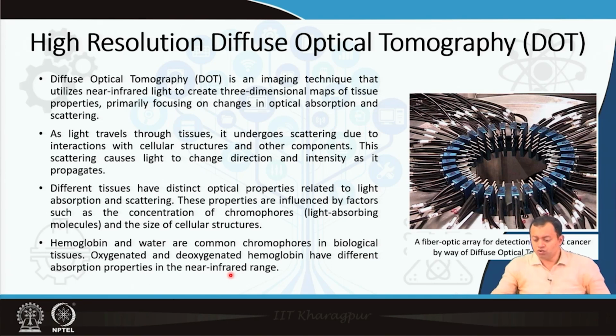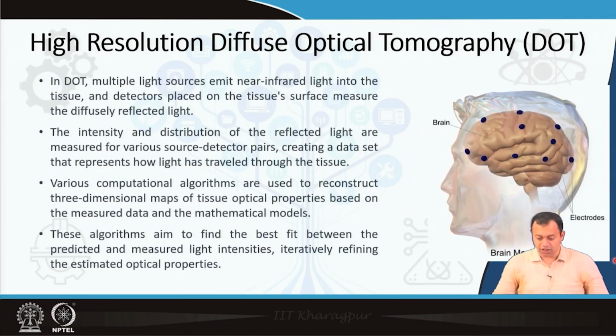image. So, this is the overall fiber optic array for detection of breast cancer. So DOT is not specifically for brain only. This can be utilized for other types of diseases as well. Here it's for breast cancer detection.